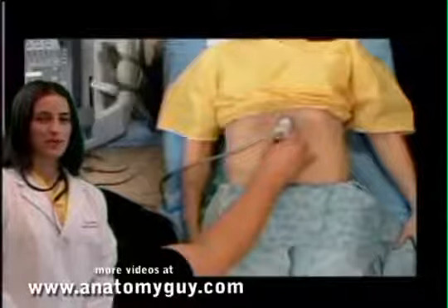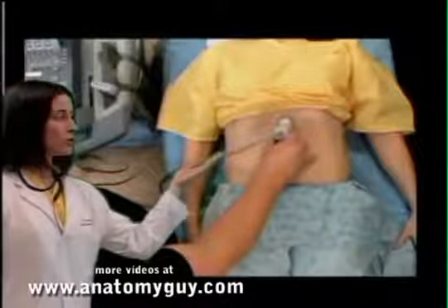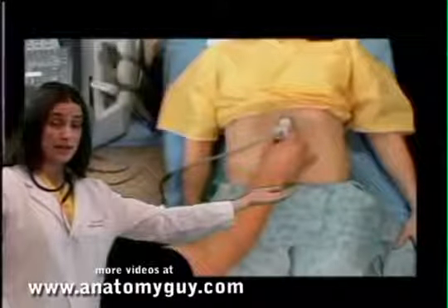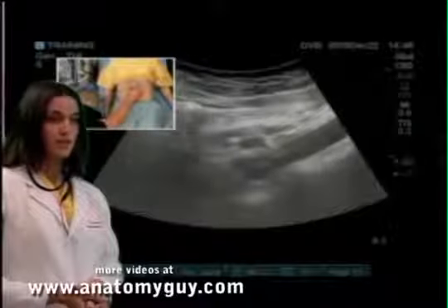Let's go back to the ultrasound table so we can look at some of these in a clinical scan. To scan the abdominal aorta, we first start with the probe marker positioned up towards the patient's head. The probe is positioned just to the patient's left of the umbilicus, a little left of midline. Next we show what we see on our bedside ultrasound screen.